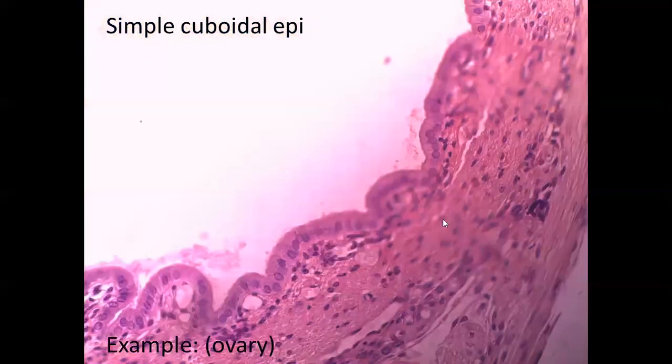We have another example, covering the surface of the ovary. This surface of the ovary is covered by simple cuboidal epithelium. The layer below will be explained later; it is connective tissue, but this is the epithelial tissue. Why do we call it simple? Because it consists of one layer of epithelial cells.